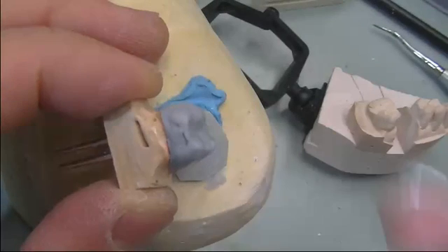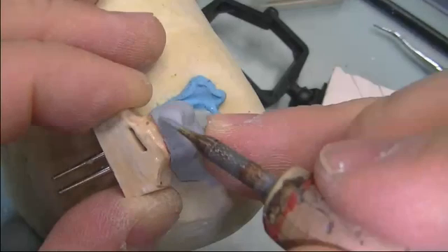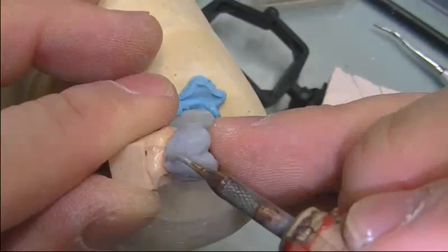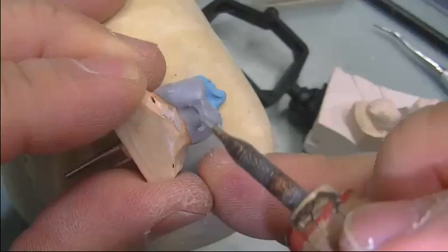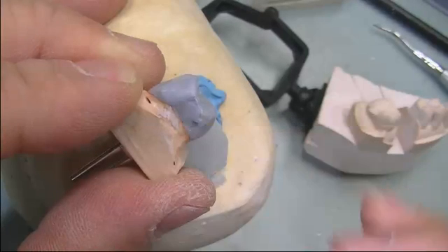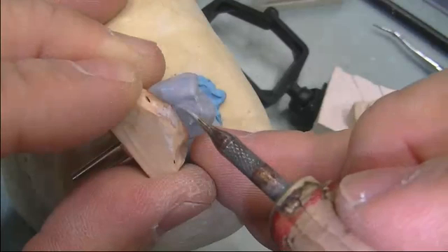Now we remove the die and fill in on the proximal contact area, touching up the margins. Continue to add and fill in all the deficient areas.